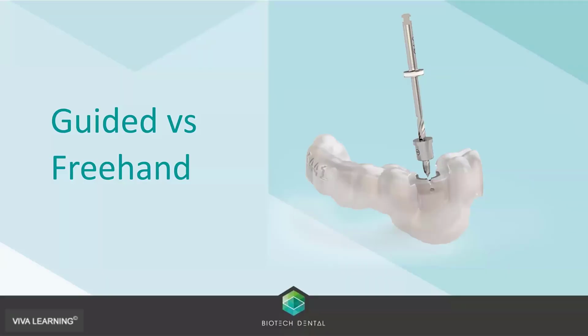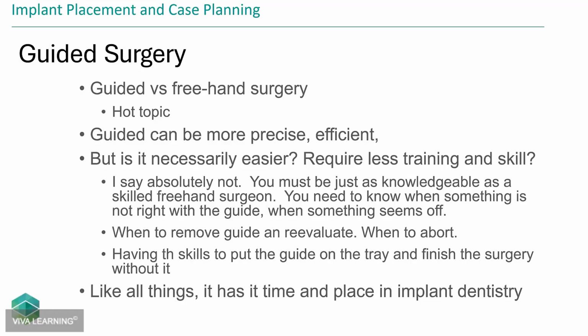Now, when it comes to guided versus freehand, that is, as I've trained people, implantology, it's always a hot topic. When do we guide? When do we freehand? In my opinion, get very, very good at freehand and then do more guided. That's what I've done. I'm doing more guided than I ever have, but I used to do almost everything freehand.